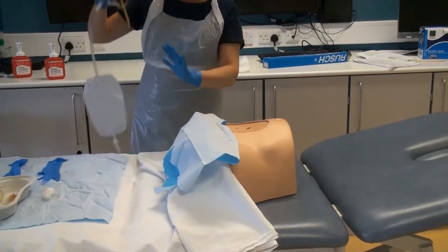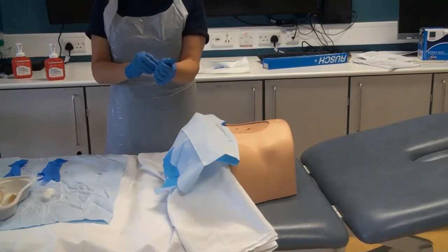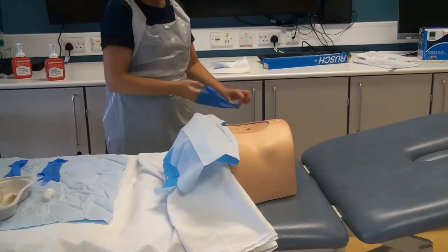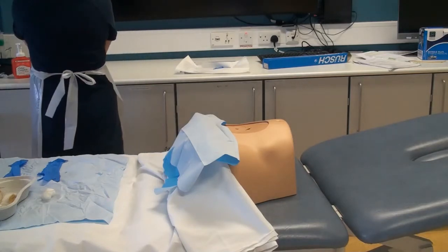This may be helpful against your hand or a measuring tape. Dispose of gloves and the old catheter, decontaminate hands, and don your second pair of sterile gloves.